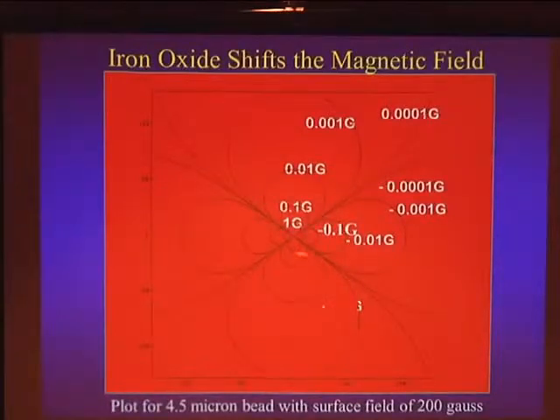And that's because a little bit of iron oxide changes the magnetic field because it's magnetic. And MRI is wonderful at measuring magnetic fields to about 10 parts per billion. So if there's just a very small change in magnetic field, we can tell something has disturbed it. So if you take a micron's worth of iron, you will see shifts in magnetic fields up to 150 microns. Small shifts, but shifts that we can detect. So the trick to seeing single cells is not resolving the cells, but getting enough contrast so that they bloom large so we can tell they've been there.